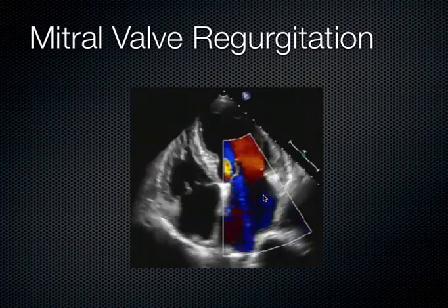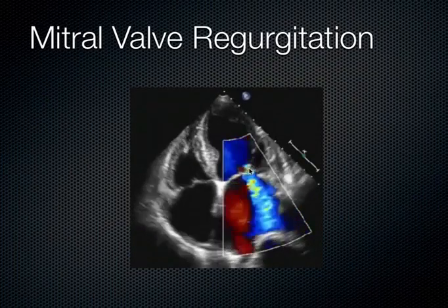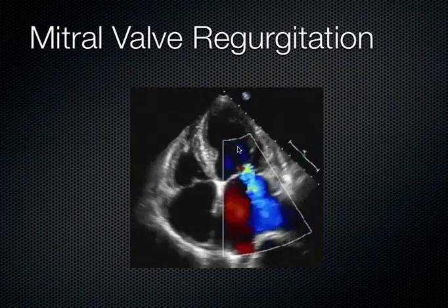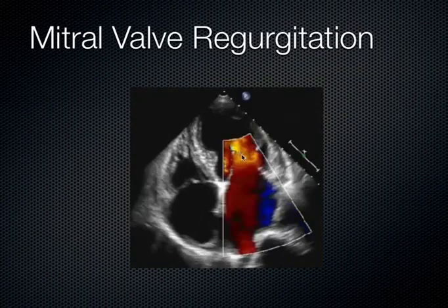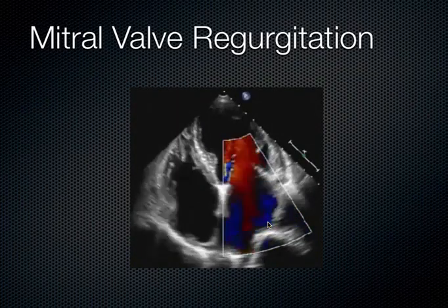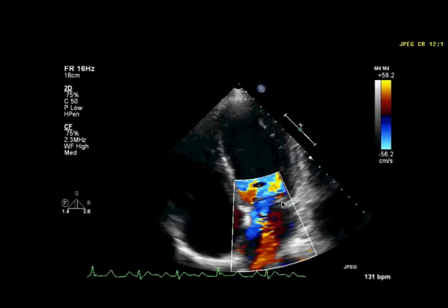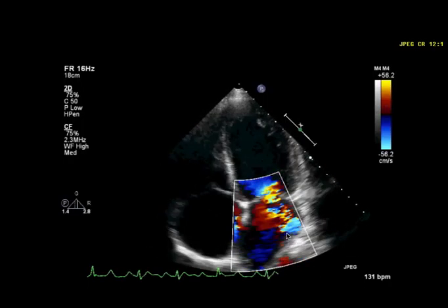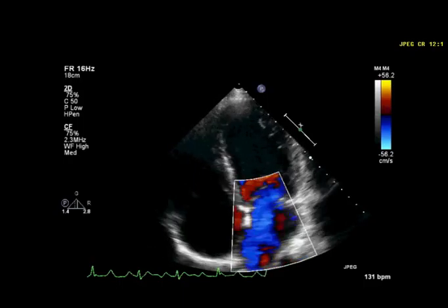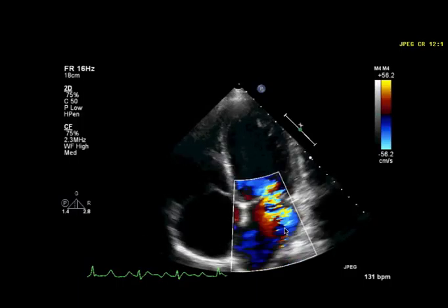During diastole, we see the red come right up into that ventricle, which is what we expect. But then during systole, we see all this blue away right through that valve. That's severe mitral regurgitation when you see that. Put another way, we see another blue jet on this other heart squirting to the back wall, and that's not supposed to happen. That valve is incompetent, and we have a lot of blue away happening right there.